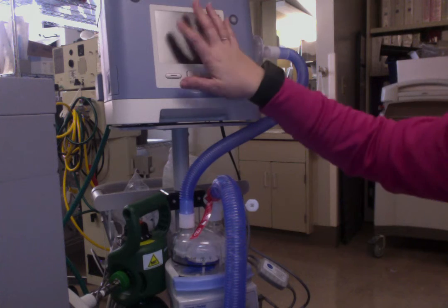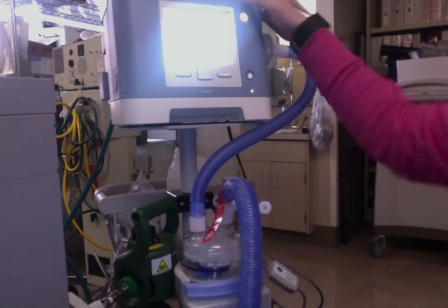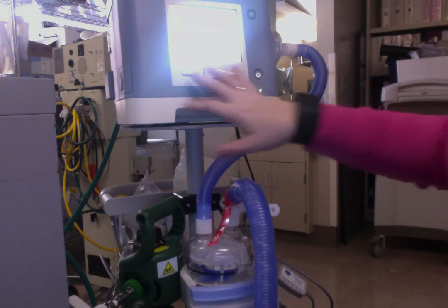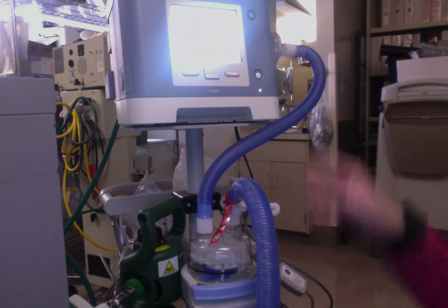You can't really see the screen when I'm recording, so I'll just kind of explain what I'm doing to set this up initially. I'm going to start by muting the alarm, and then it's going to automatically start ventilating on the previously set settings from before you turned it off.